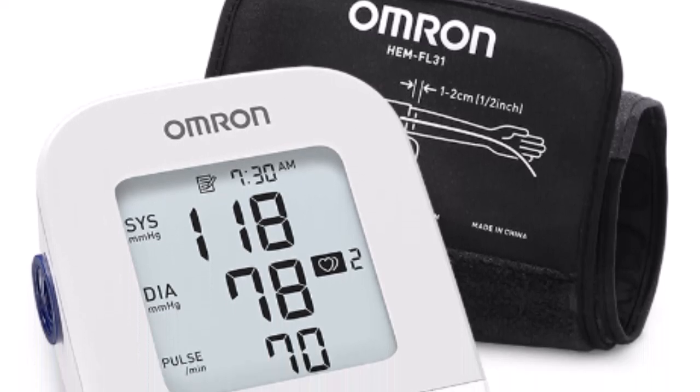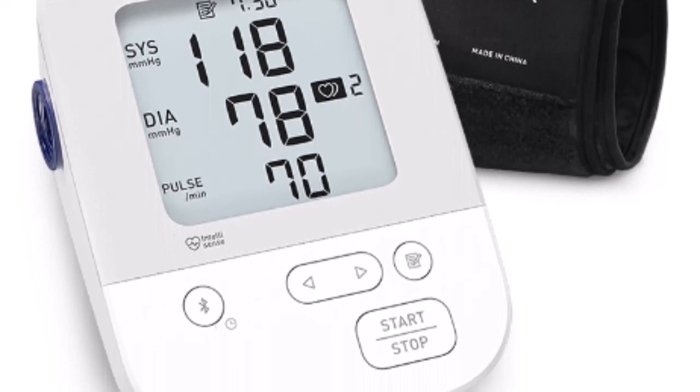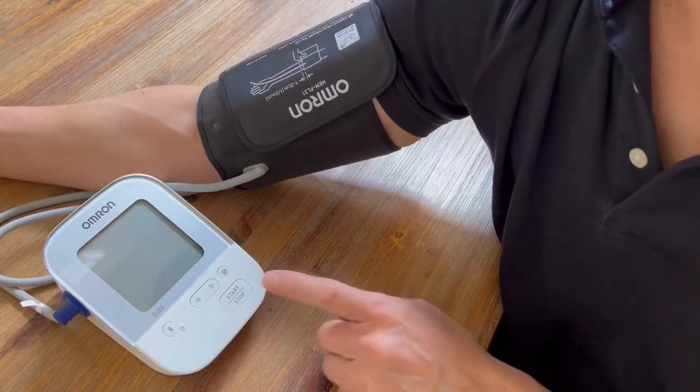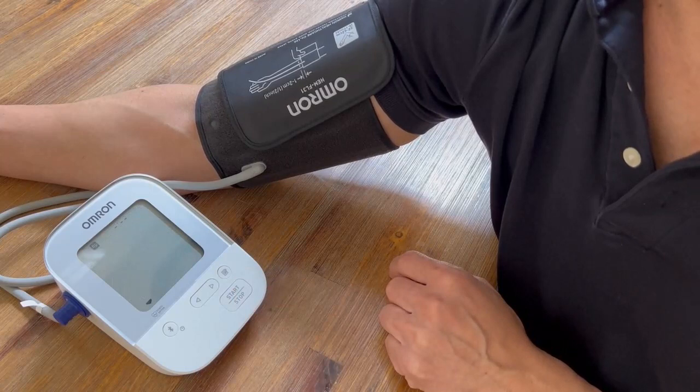You know what's even better? It can store up to 200 readings so you can track your progress and see how much you've improved over time. And the best part, it's incredibly easy to use. All you have to do is wrap the cuff around your arm, press a button, and voila! You'll have your blood pressure reading in no time.